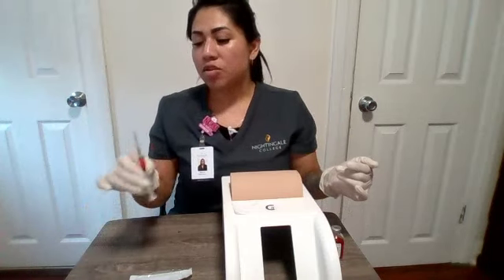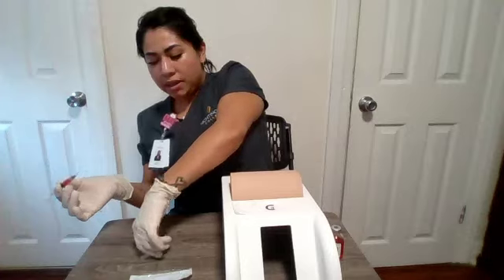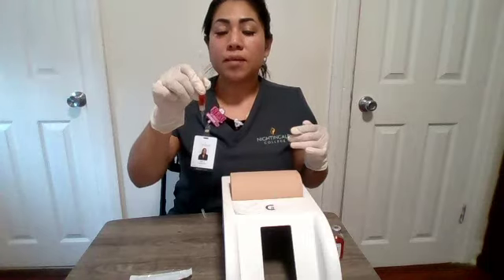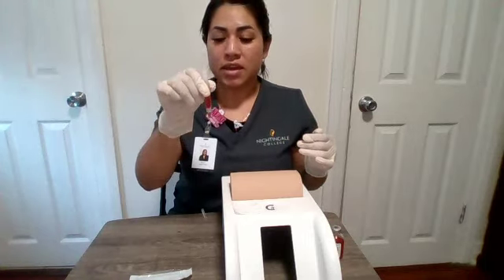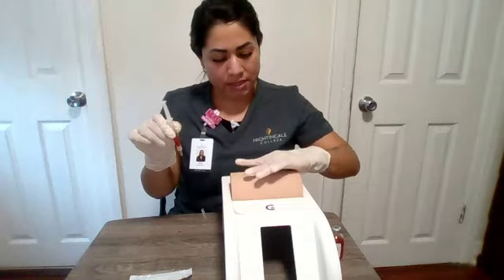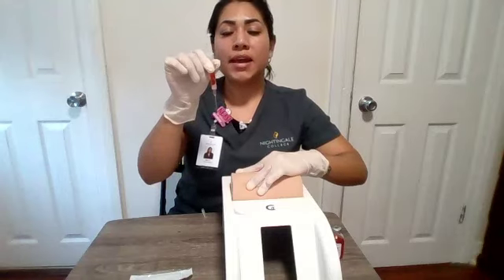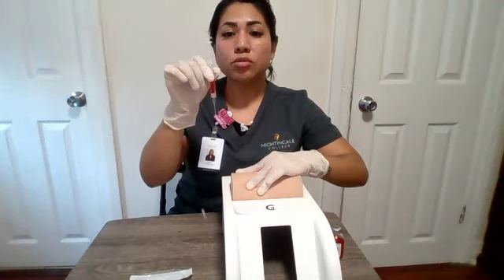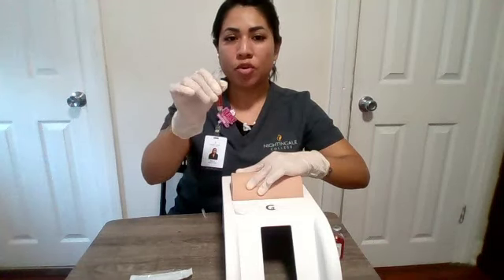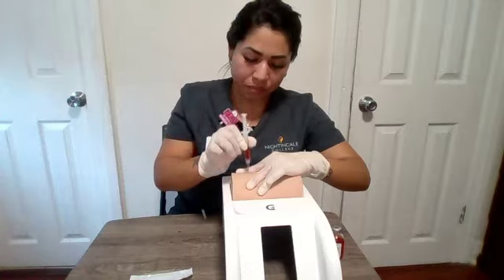Okay, so now I'm going to get started by holding my syringe between my thumb and index finger, and I'm going to be injecting at a 90-degree angle. Once I have identified my site, I will place my hand here. Then I will grasp the muscle to increase the muscle mass. And with my dominant hand, I am going to quickly inject straight in at a 90-degree angle.